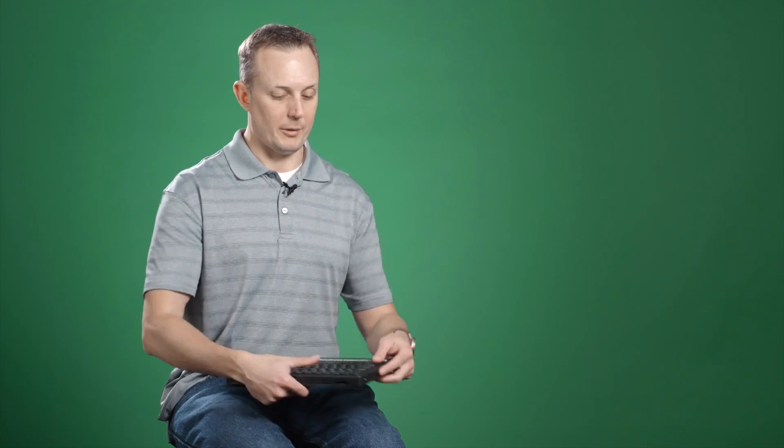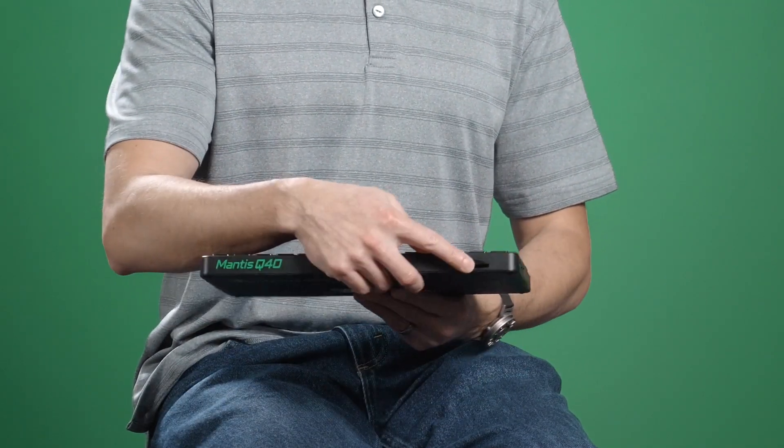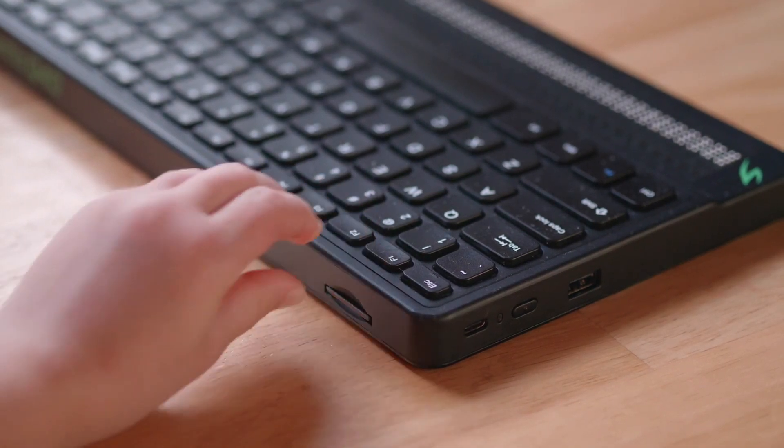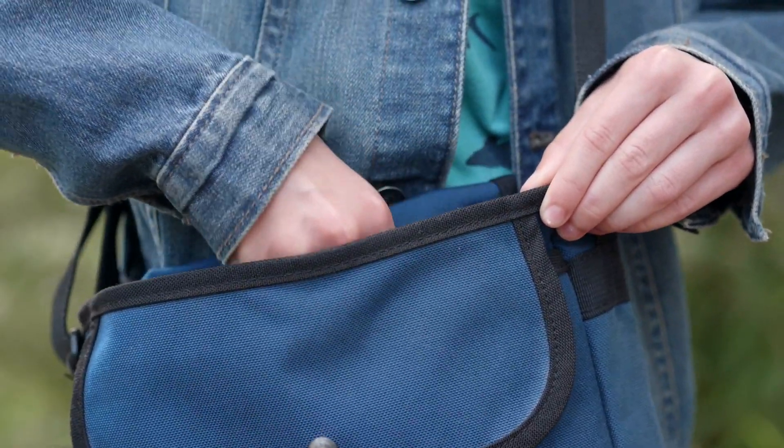The Mantis has built-in storage so that you can save files and books — it's got 16 gigabytes of internal storage. In addition to that, you have a USB port on the side that you can plug in a USB thumb drive, and an SD card slot on the back that can take up to a 64 gigabyte SD card. And it's all in a portable device that slides into a laptop bag or a backpack and just goes with you.